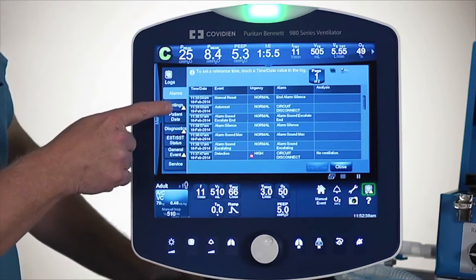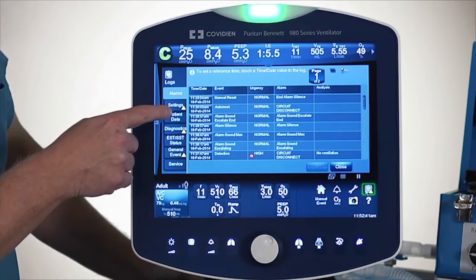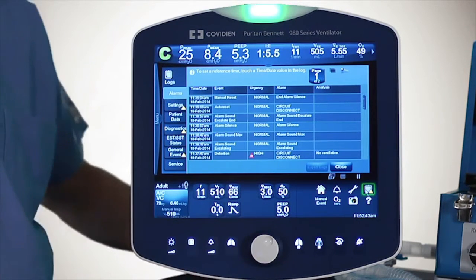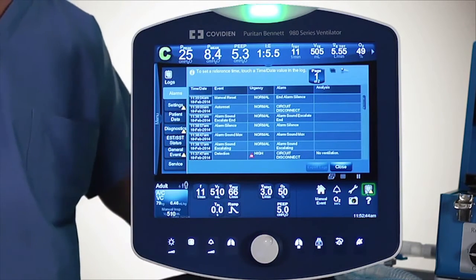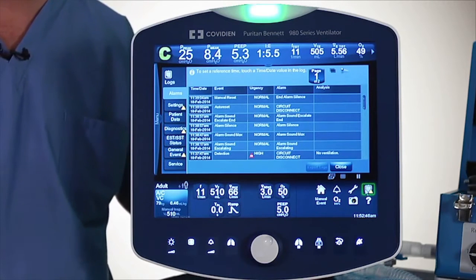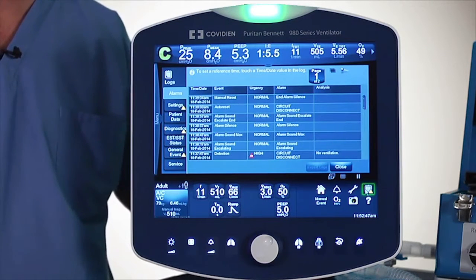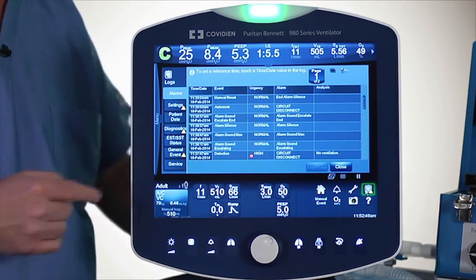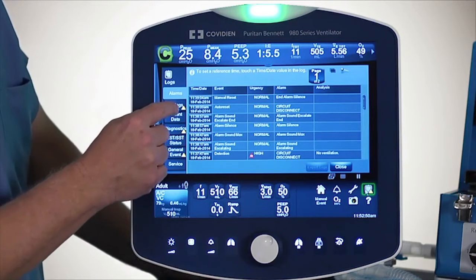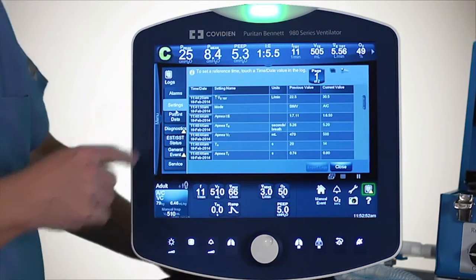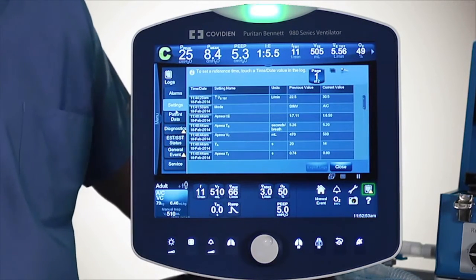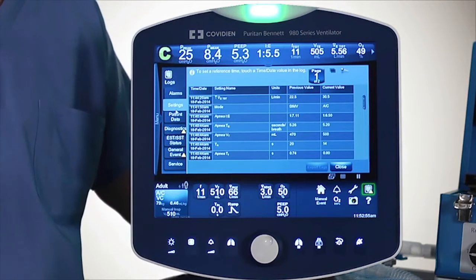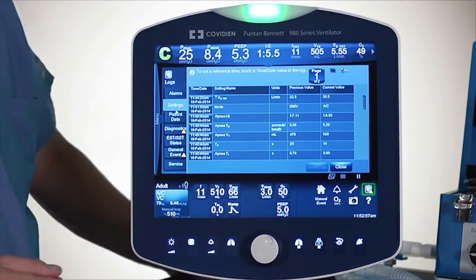For example, this little settings log here. That little yellow triangle means that there was a setting change that you just haven't viewed on that log screen. So I'm going to touch that settings area, and notice how the yellow triangle went away. You may be wondering what that little yellow triangle is for.